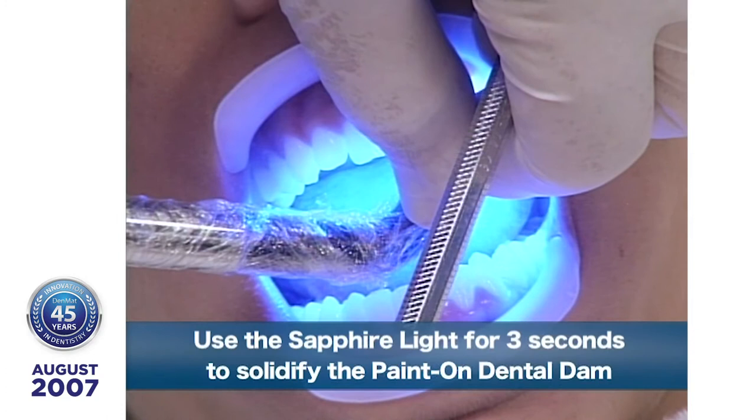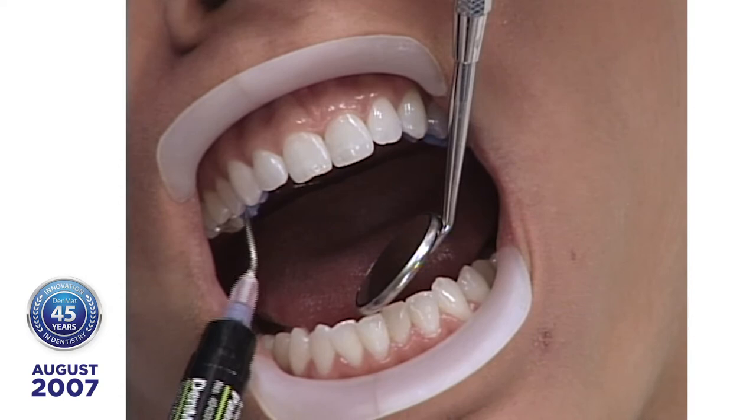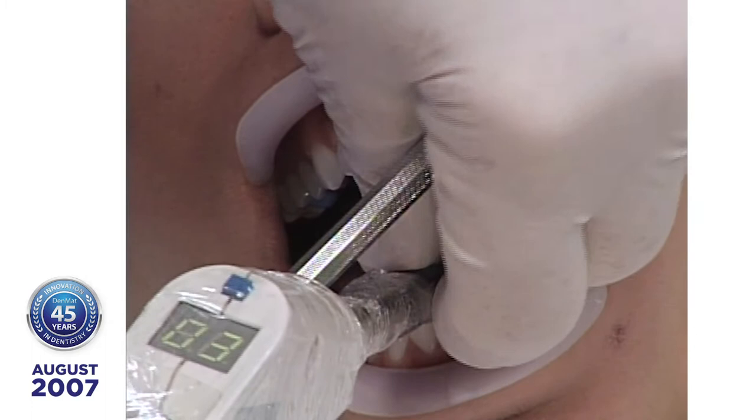We're not trying to set a speed record here — we're just trying not to waste time because your time is limited, and to show you what you could be doing in your practice. You could be taking impressions tomorrow and begin doing this right away. You'll see why this is so important because it really facilitates cleanup.